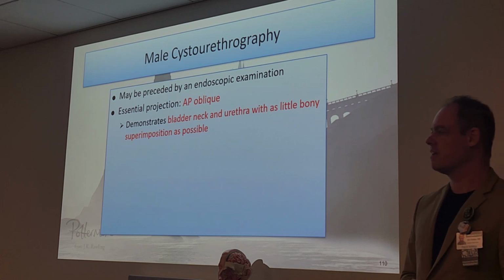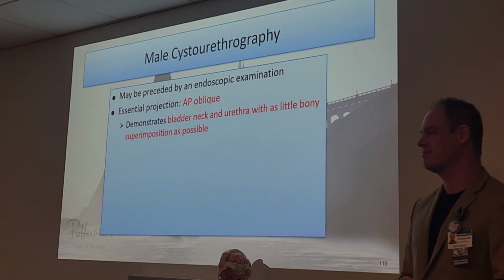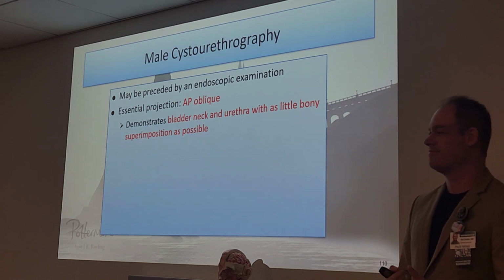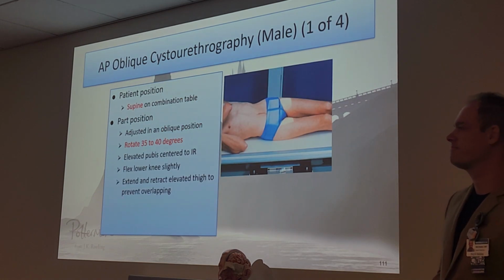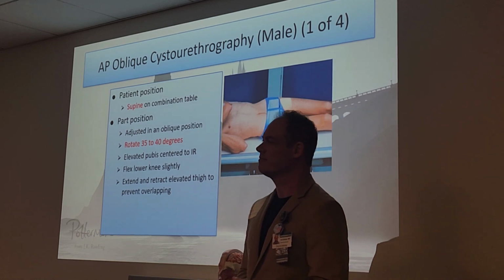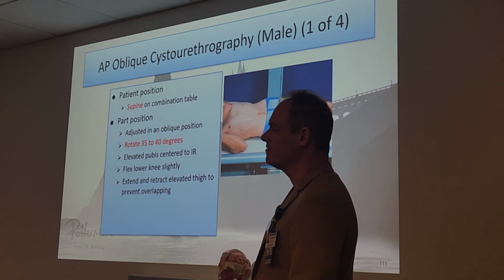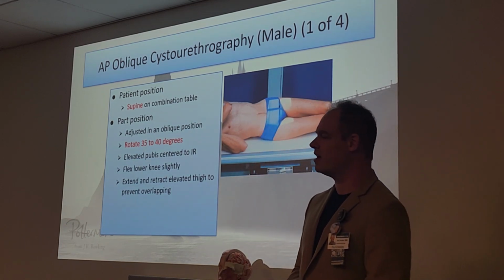What if they're passed out or what if they're special needs? I'm just saying you don't know what your patient's condition is, so you might have to assess. You can tape it. Oh, yeah. Tape it. Just be careful when you pull the tape off.